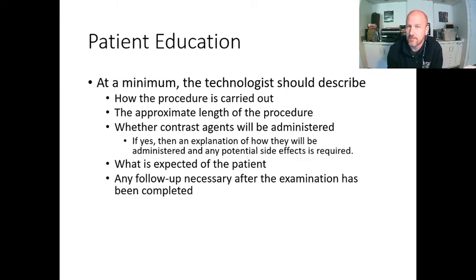Now, the reality is, when we're talking about these CT protocols, there's a lot of stuff in the CT scan room that can kill a fool, right? Straight up. I'll tell you, like the tech told me when I was first learning CT. She pointed at the CT scan table and she said, there'll be no births, deaths, or conceptions on this table, right? And probably the one she was most concerned with was the deaths one. Because for real, the IV contrast injector can kill you, the CT scanner can kill you, negligent techs can kill you, the IV itself can kill you, the contrast itself can kill you, and any kind of procedure can kill you. So there's a lot of risks, related to radiation and so on.